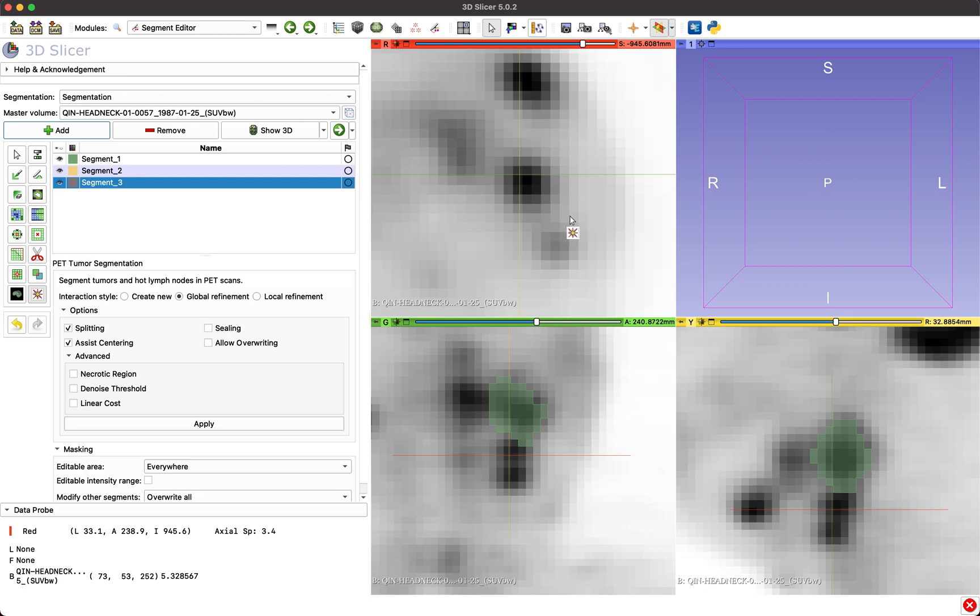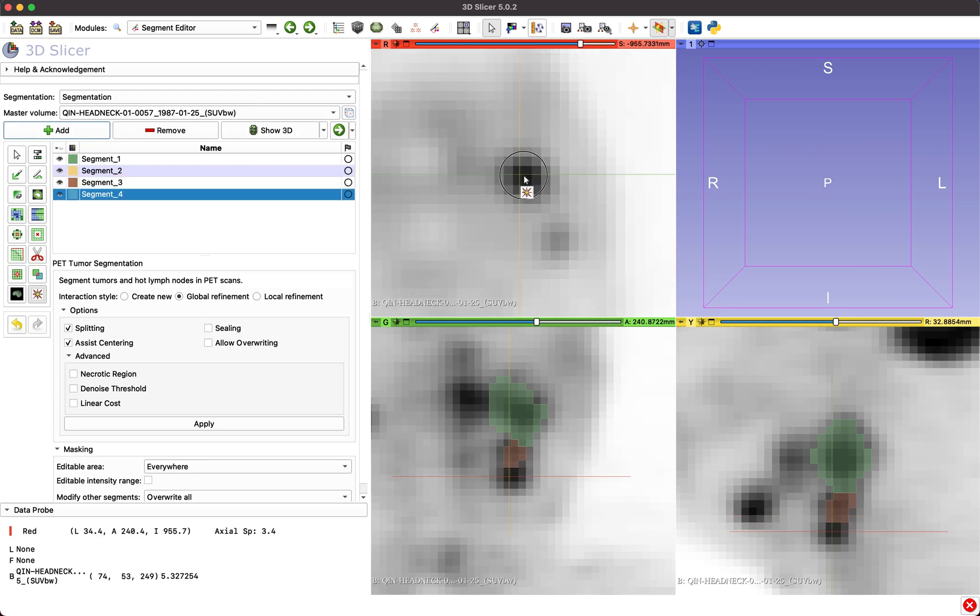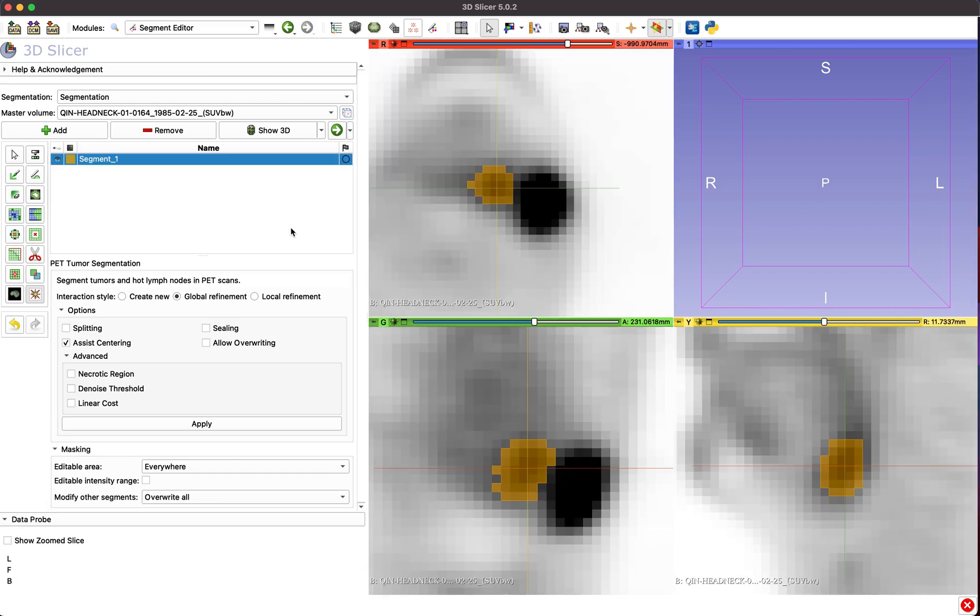In the case of small, low uptake lesions adjacent to large, high uptake regions, it is advisable to segment the larger lesion first.